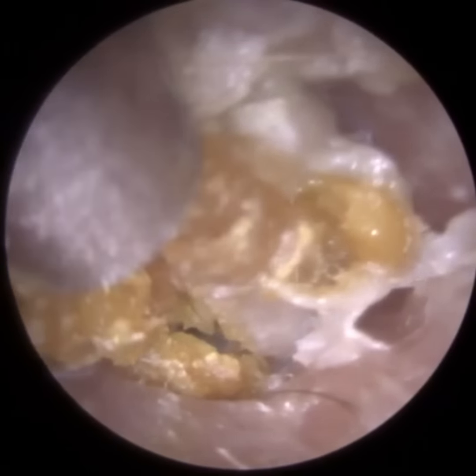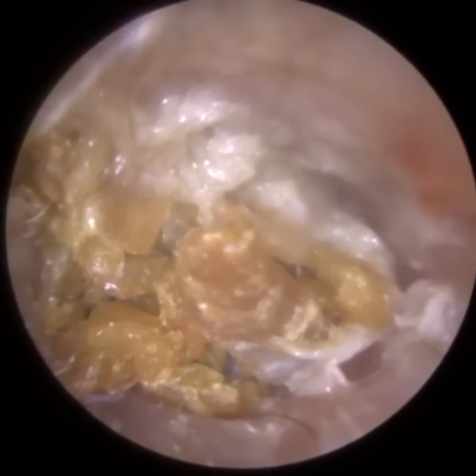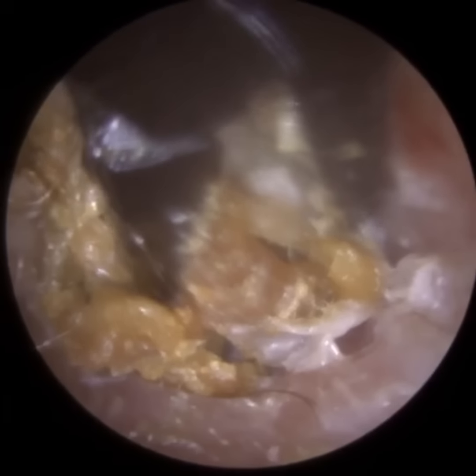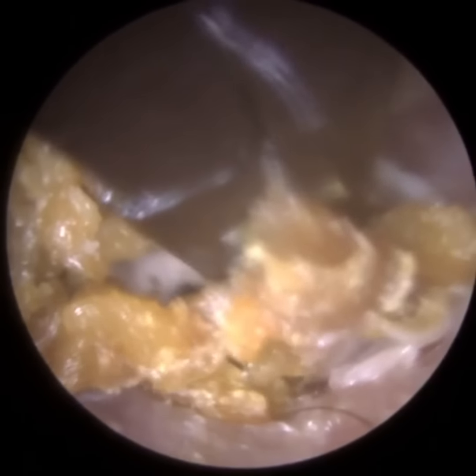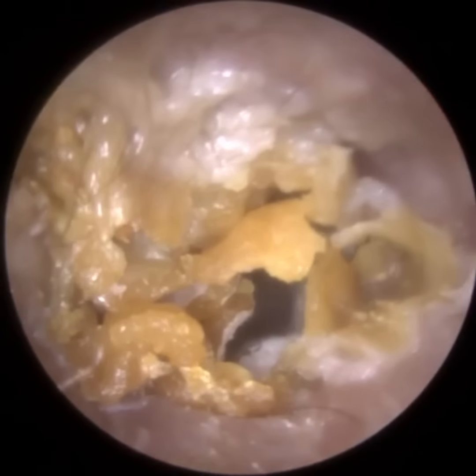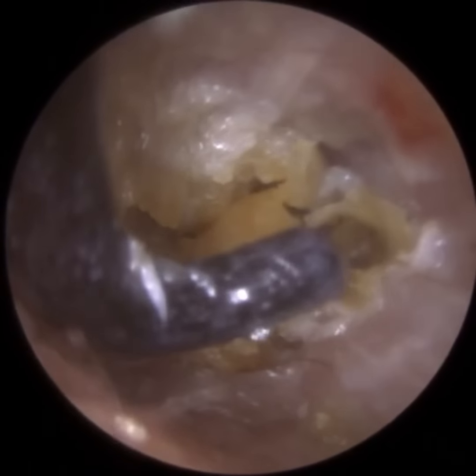And for me, the view is so critical because it helps me not only visualize the earwax safely, and it also tells me which part of the ear canal I'm in, but it enables me to manipulate the plug of wax. I'm treating the plug of wax or skin as one. Quite typically with other visualization techniques, your view is quite narrow, so you're only seeing part of the plug, and therefore you may not be manipulating it in the correct way to bring it forward.